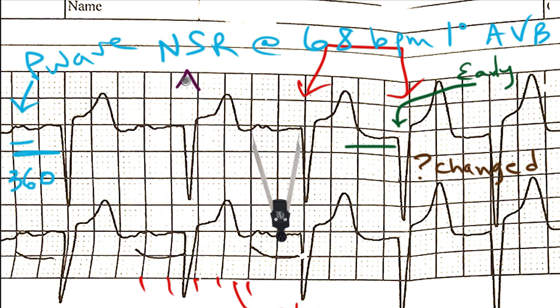Well, the attending cardiologist called this an accelerated junctional rhythm, and I imagine he based it on the fact that it's a bit faster, that there's no P wave in front of it, and that the morphology changed ever so slightly. How many people would agree with that? Well, there was a bit of discussion about what this rhythm was. Accelerated junctional rhythm is a reasonable diagnosis to consider.